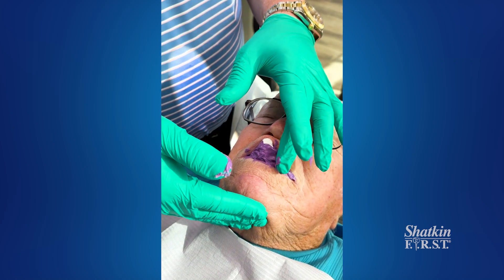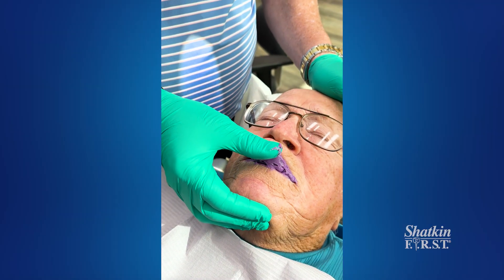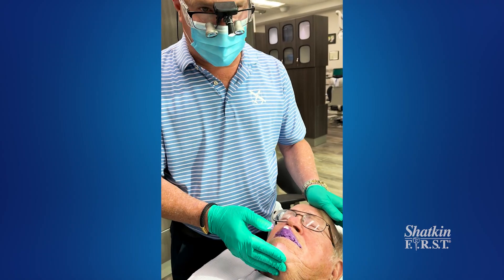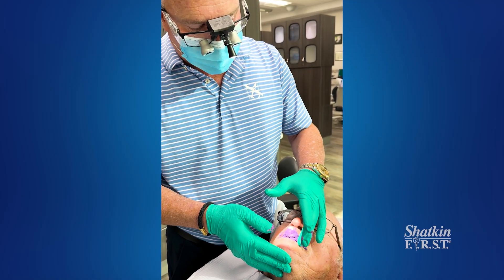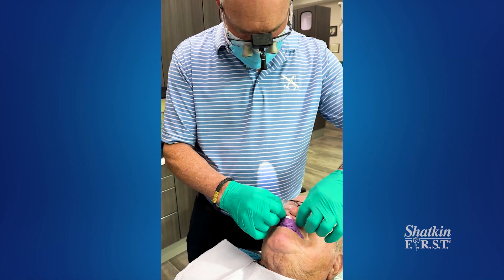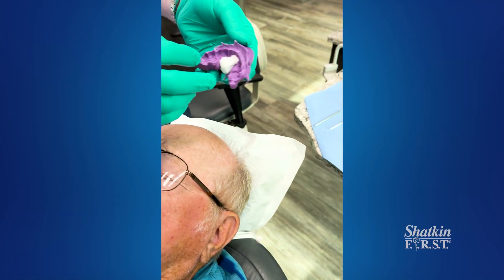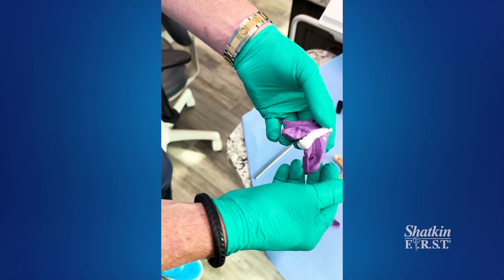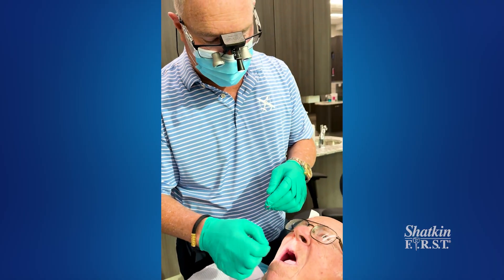Keep staying still — almost done. Ideally, you take impressions and have a wax bite rim made and have him back, but this saves at least one visit. Keep biting — almost set. Okay, let's take that out. We got good imprints of the teeth on the ridge, and that should be sufficient for the lab to do a mounting. So now my assistant will take an impression of the upper and an opposing.